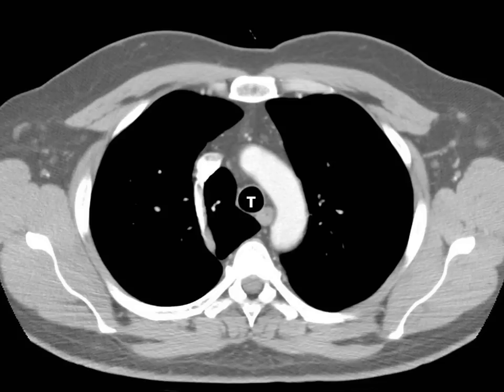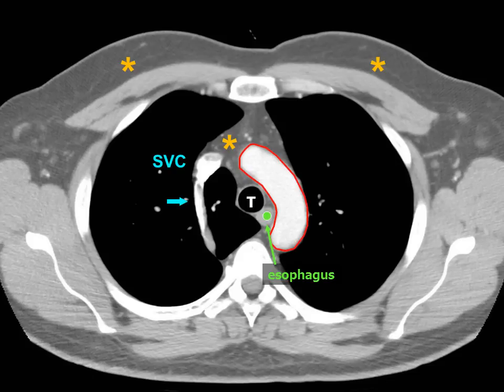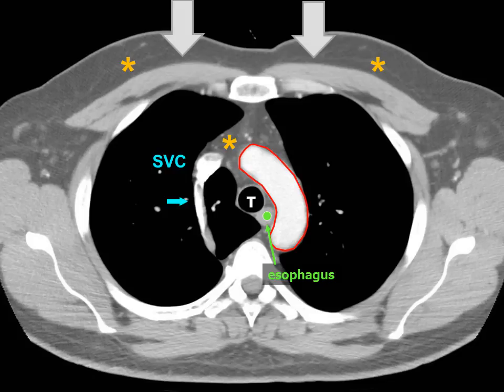If we look slightly lower in the same patient but now with soft tissue windows, we can see once again the T outlining the trachea, mediastinal fat, and subcutaneous fat. We can see where the esophagus is located, outlined in red the arch of the aorta, and the superior vena cava with contrast opacifying the azygous vein as it passes in between these two segments of lung parenchyma.